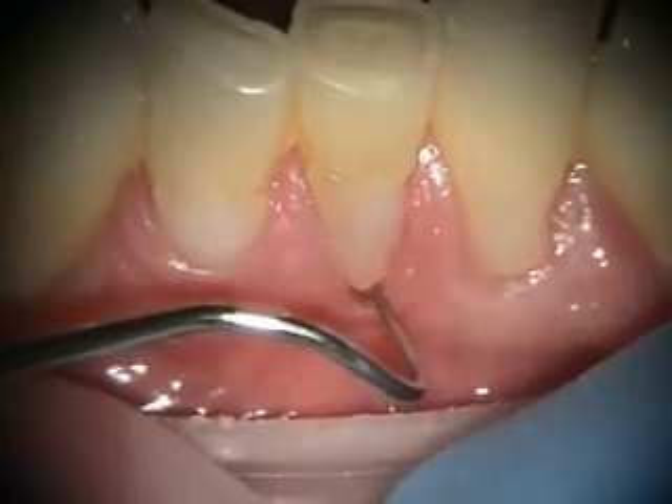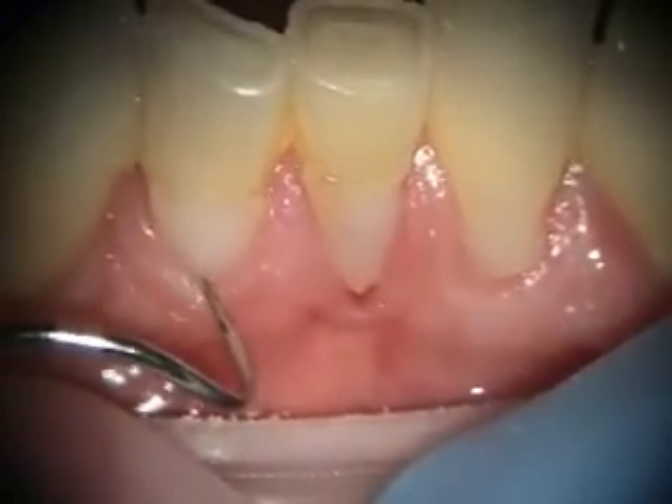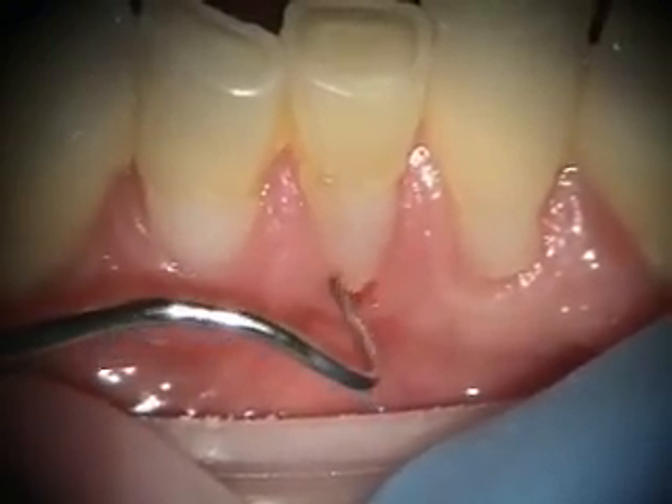If it hadn't been for this overhanging margin — and he's got one here as well, and here as well — his tissue would probably be healthier.